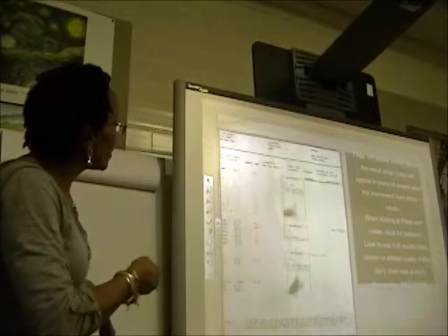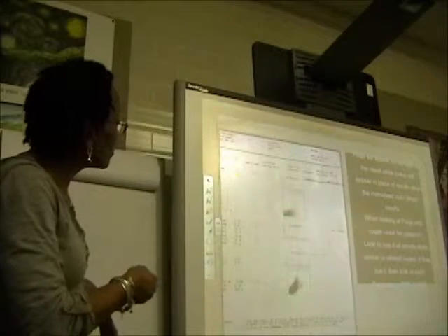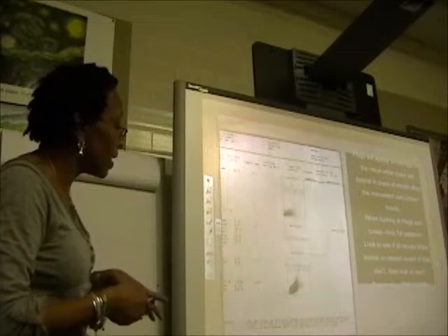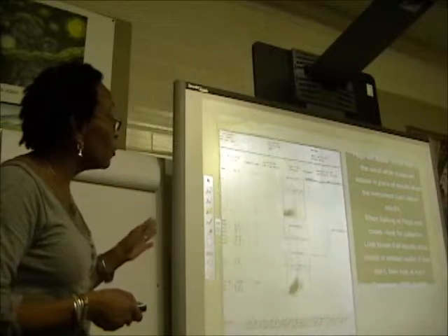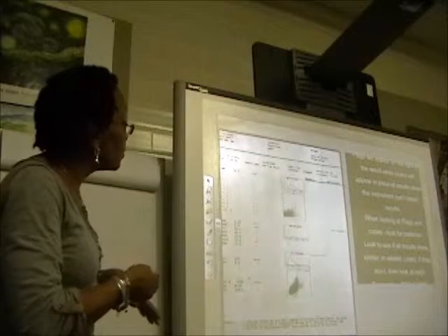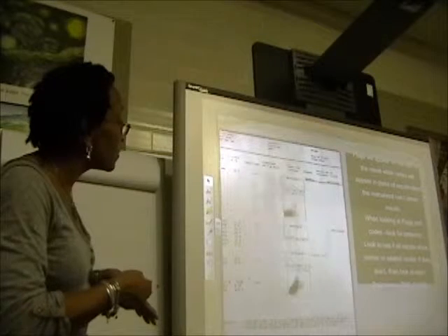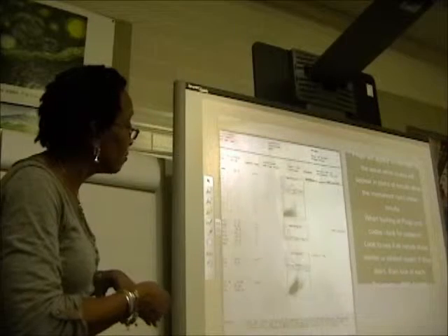So here's an example of the codes. When you get this code, like the string of colons, it's going to tell you that either you've got clots in the sample, or the flow cell is clogged on the instrument. And you can see that you don't have any separation in the cells right there, so you know it's something really going on to cause this. So you're going to have to look at it. And then right here, you've got your platelet clumps.